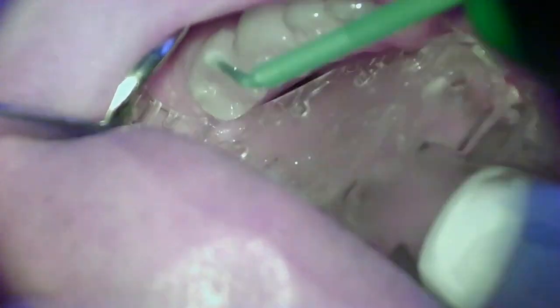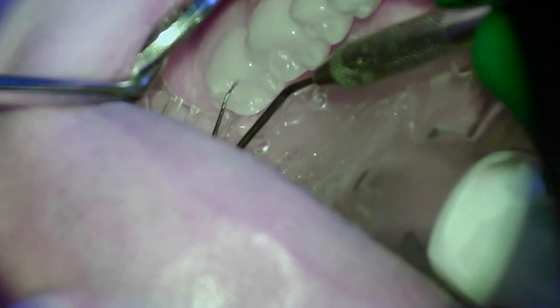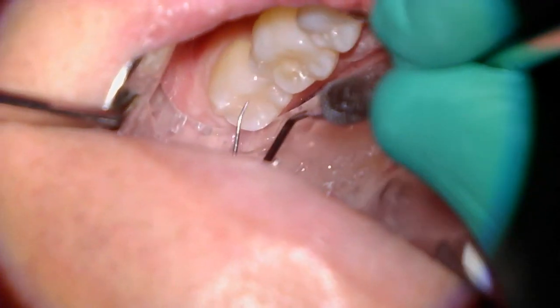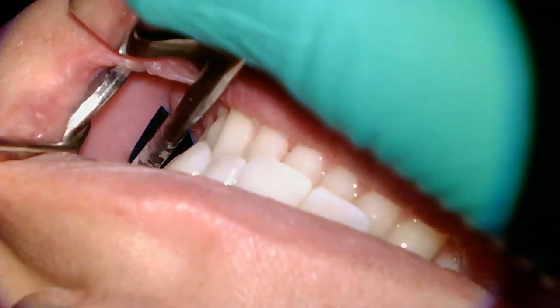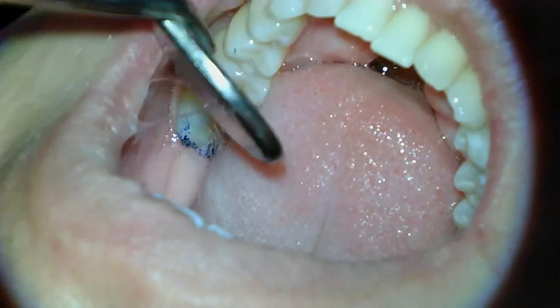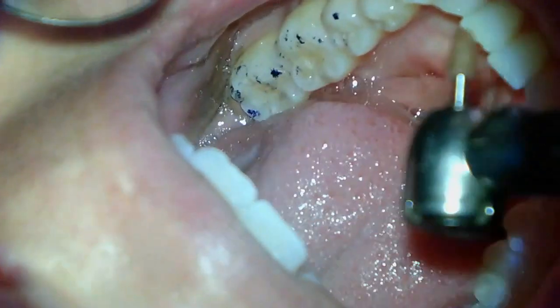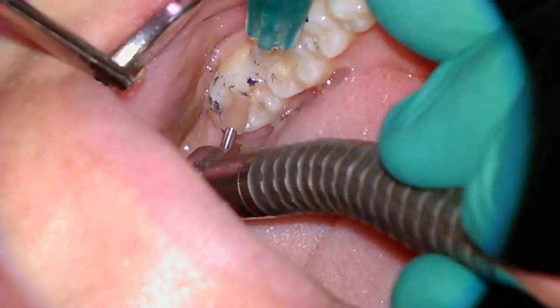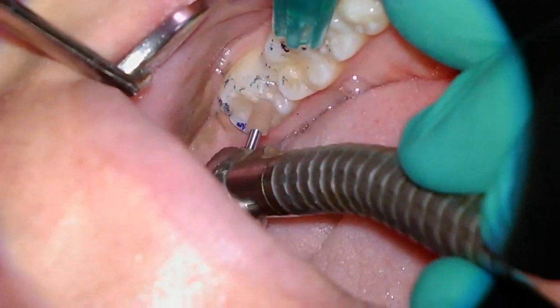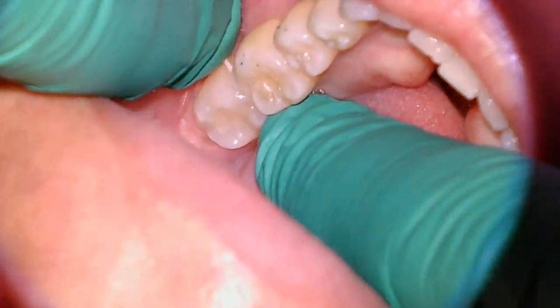Once the resin has been placed, we're going to light cure it and the doctor is going to double check with the explorer to make sure the resin is fully cured. We're going to remove the dry shield and check the occlusion. The doctor will start adjusting those high spots and do some polishing. We'll also do some flossing around the tooth to make sure any flash from the bonding has been removed, and we'll give our patient one last rinse.